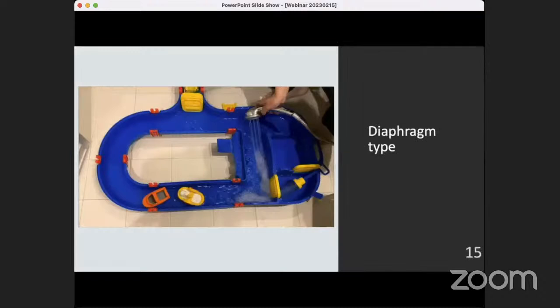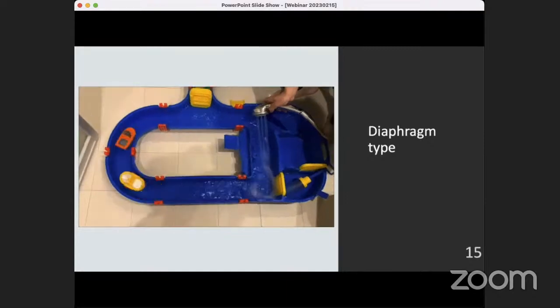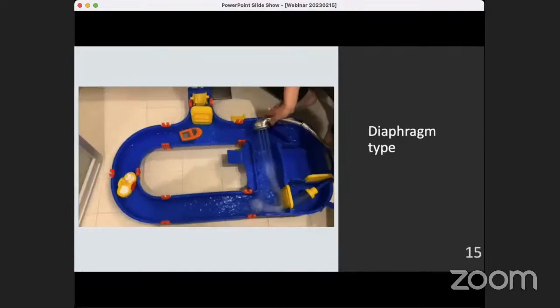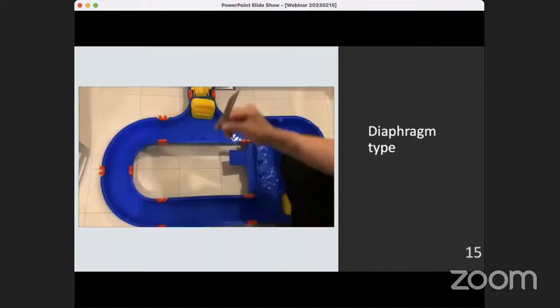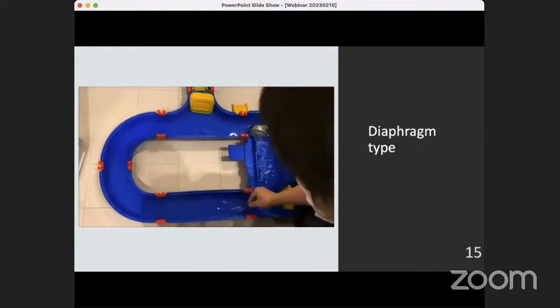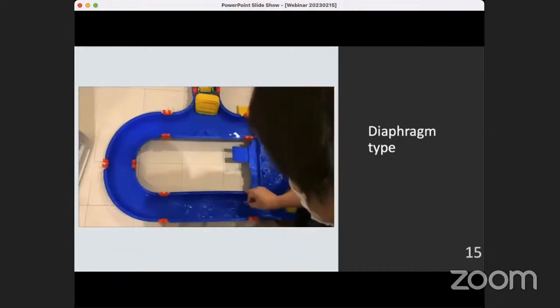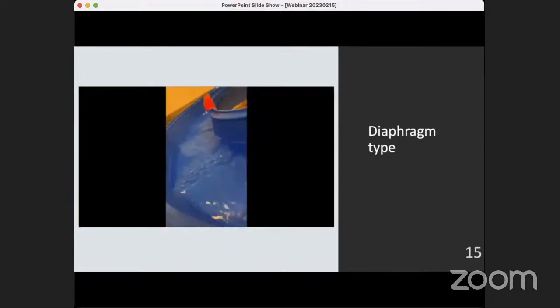To make it a little easier to understand, I will use the flow of water to explain. The flow of water produced by the shower is the steady flow in the HFO. The intensity of this flow is like MAP. The ruler represents the role of an oscillator, and its frequent movements create waves. This wave represents the pressure change of the HFO.